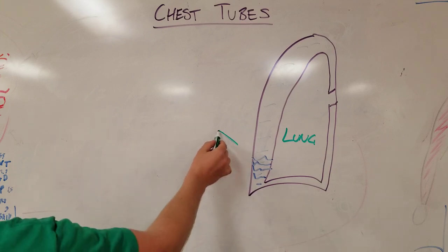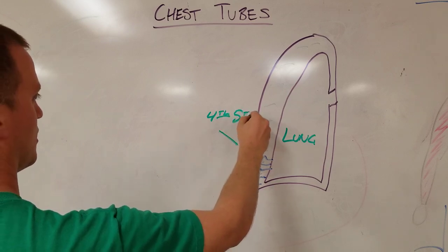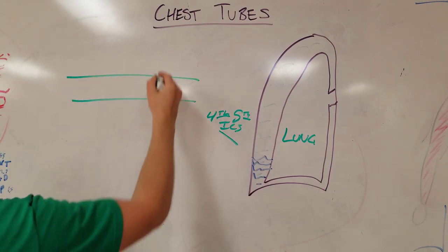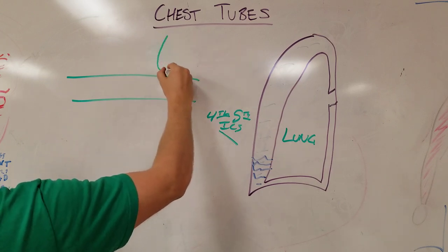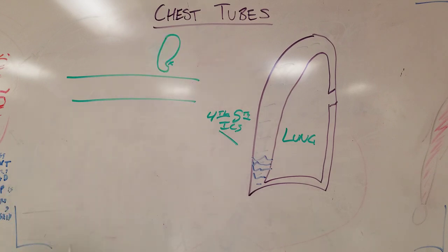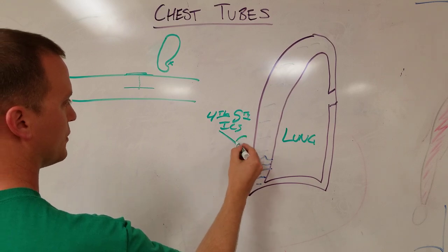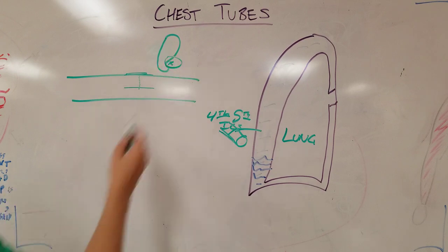And so what we're gonna do is make our incision over the fourth or fifth intercostal space. We're gonna dissect down through the soft tissue. We're gonna get to the rib. Now, when you look at your ribs on cross section, at the bottom, this is the poor drawing, on the bottom it has this lip of bone to it, and that's because this is where the neurovascular bundle lives. And so when we're going in, we're gonna try and go right down onto a rib, and then work our way up above the rib. So if this is a rib in space, we're gonna go right above it into the chest wall to try and avoid this neurovascular bundle, okay?